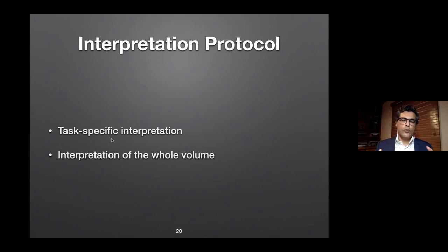Now, we have not only imaged that posterior mandible where the implants will go, but we have imaged from here all the way to here, from the base of skull all the way to the inferior border of mandible. So the whole data set, the whole volume, needs to be interpreted as well. And that's an important thing to keep in mind. So let's see what the literature says about that.